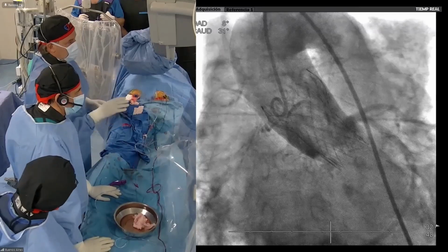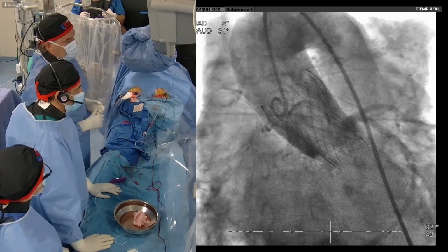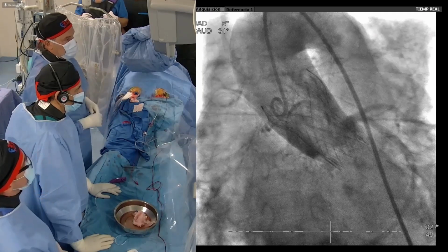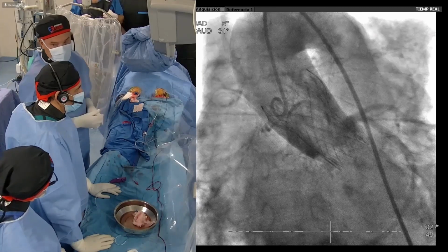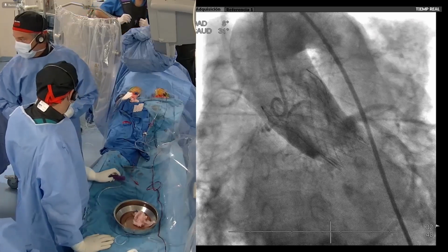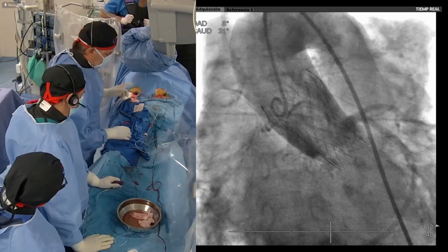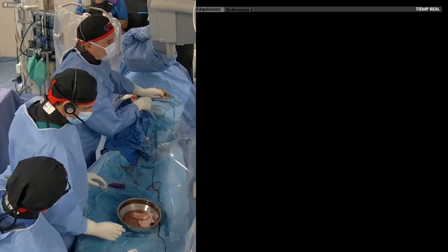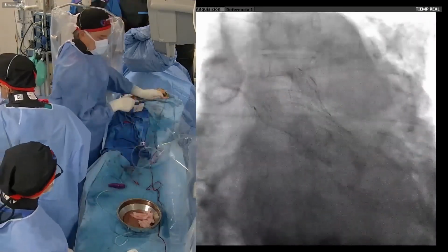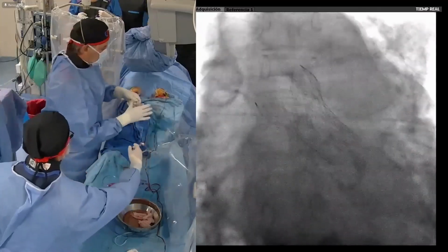We can observe how free is the left ostium. Also the perfect filling of the right coronary artery. So both pedals are oriented perfectly in the right view. In the left view, it should be the other way around. Are you okay? You think it's okay, Marisa? Okay. Marisa from Medtronic approved. So we will retrieve the catheter. No conduction disturbances so far. We will put the Lima catheter for crossover to check the closing, put an AP view.